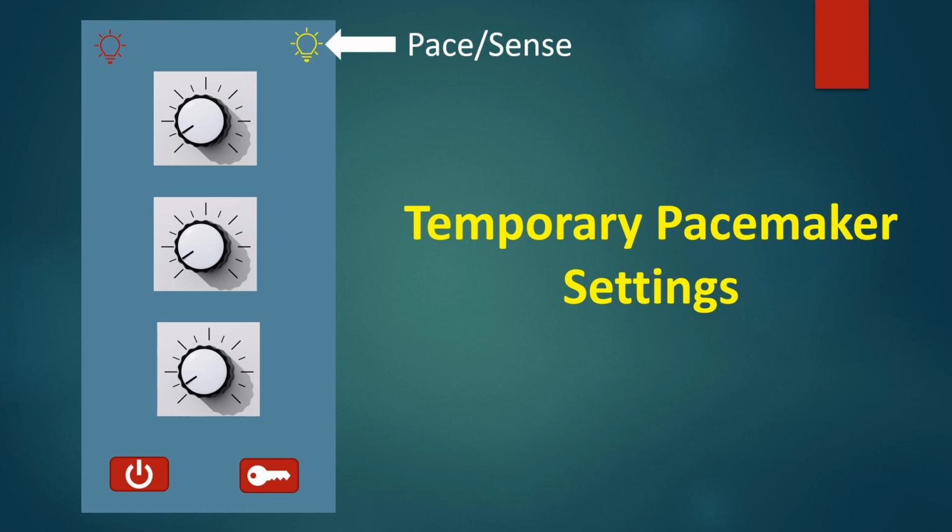color, usually green. The lock button is used to lock the settings to prevent inadvertent changes in pacemaker parameters. It can be unlocked when needed to change the settings. Pacing rate can be set as per the patient's physiological need. There will be dual rate controls in dual chamber pacemakers, one each for atrial and ventricular channels.